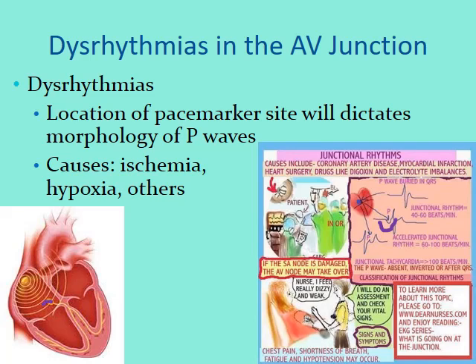And just like this picture shows, it starts here and goes backwards. And that backwards shape is why the P is inverted. Got it? Sweet.